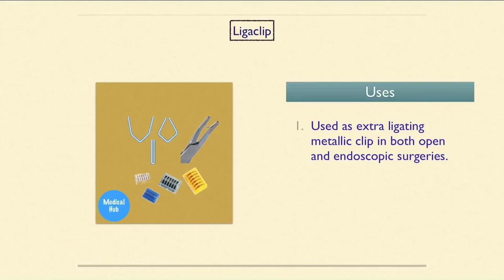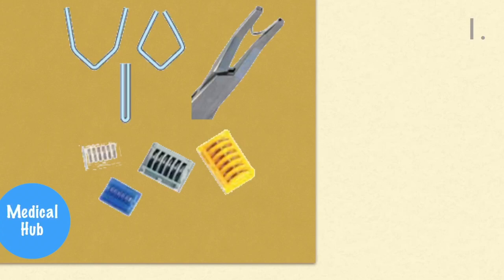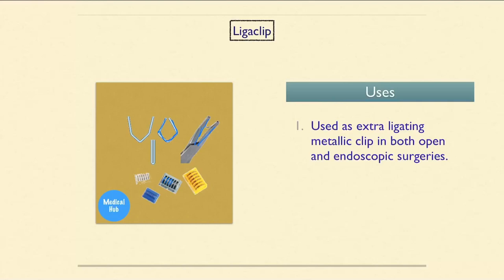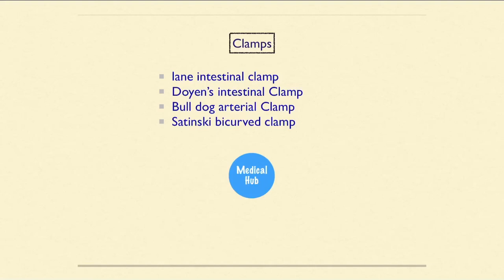These are ligaclips, kept through a clip applier instrument. They are used as extra ligating metallic clips in both open and endoscopic surgeries. Under clamps, we will discuss the Lane intestinal clamp, Doyen's intestinal clamp, bulldog arterial clamp, and Satinsky bicaval clamp.